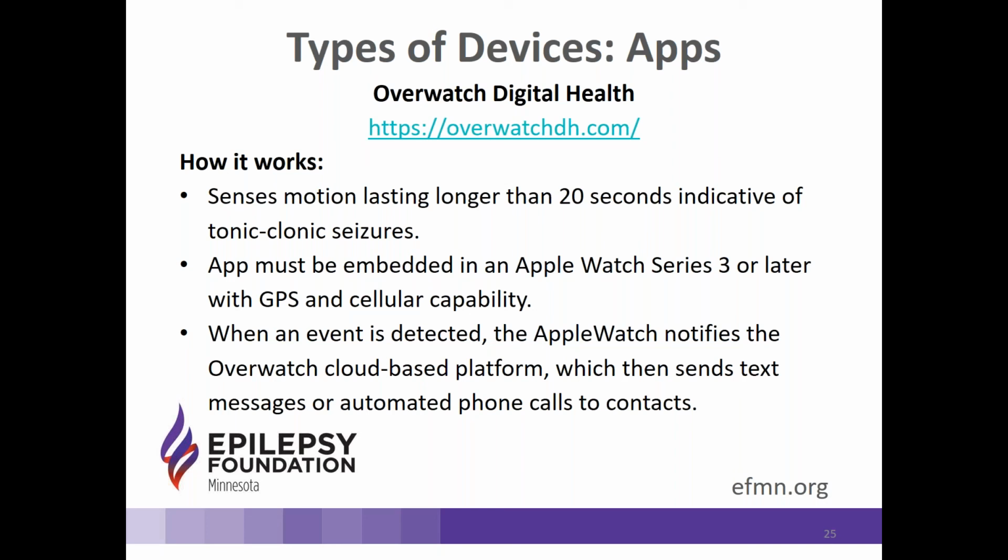They are working on the ability to work with Android phones, and the last thing I saw said that they're hoping that's going to be available sometime in 2020. I don't know if that's going to change given the COVID epidemic, whether that's had any impact on their business plans. But that was the last thing. It still says on their website that they are expecting to have the capability to connect to Android phones this year. When an event is detected with this device, the Apple Watch notifies their Overwatch cloud-based platform.